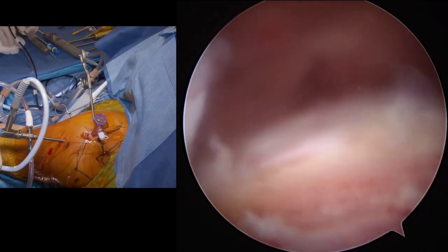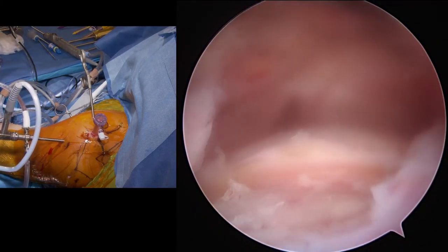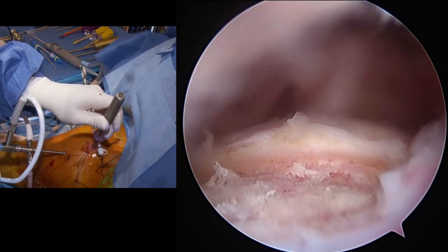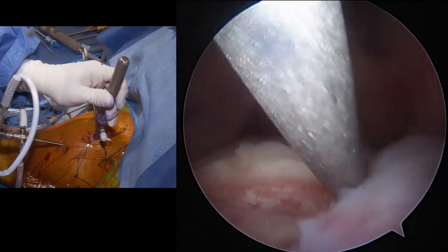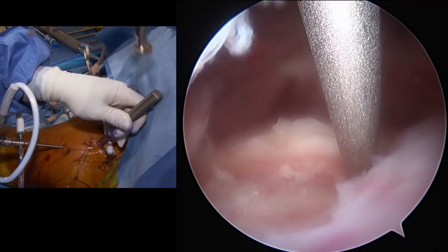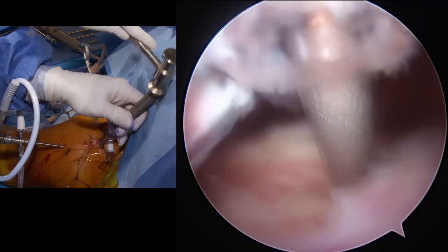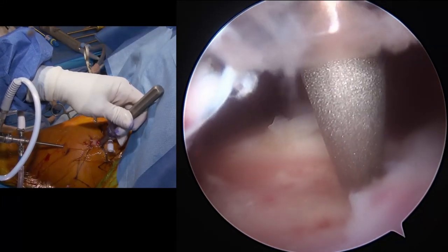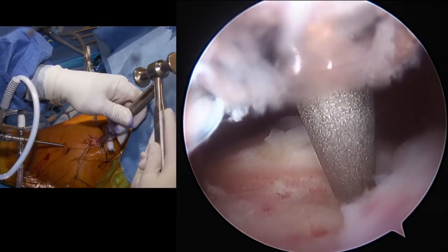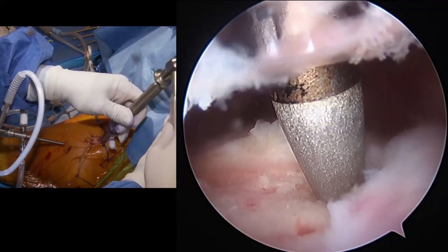Okay. All right, so let's have our first punch. We have got our corkscrew ready, right? We've got our speed bridge, yep. Thank you. Okay, great. Okay, Deb, go ahead. It's got to go to the second line. Yes. Push back so you don't hit the patient's head. You push with your other hand and then hit. You're stepping on the shaver.